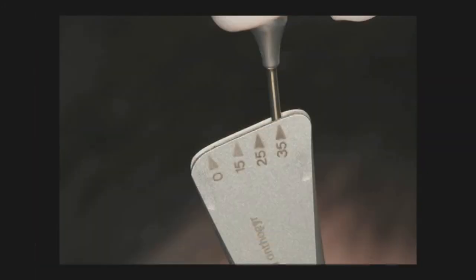Alternatively, if the torque is 35 Newton centimeters or more, in my opinion, when the implant is placed, a custom temporary abutment and provisional crown could be placed.